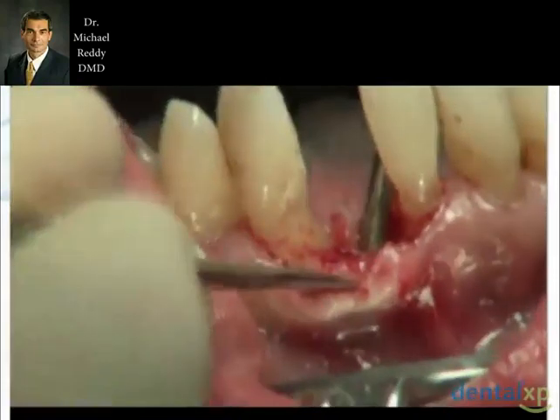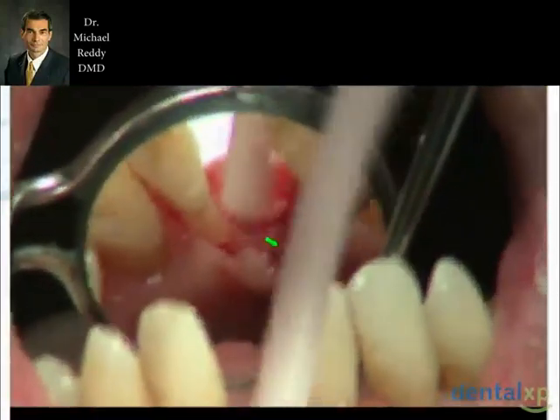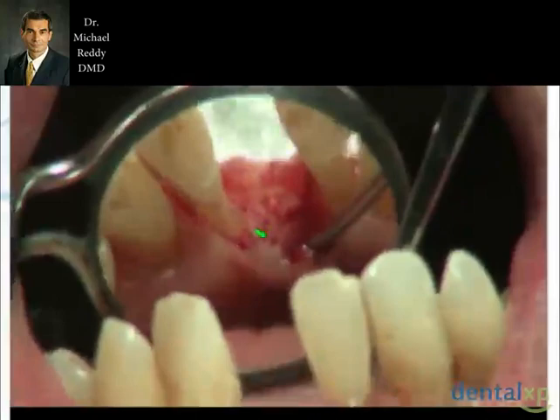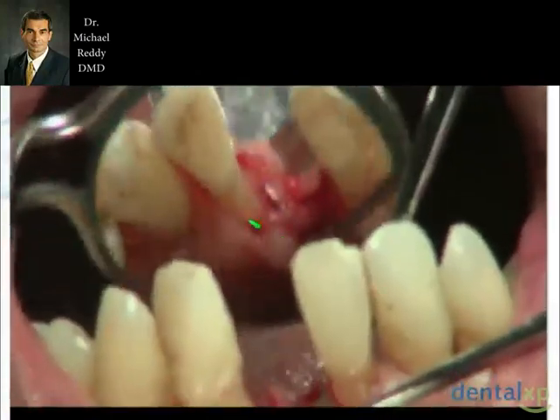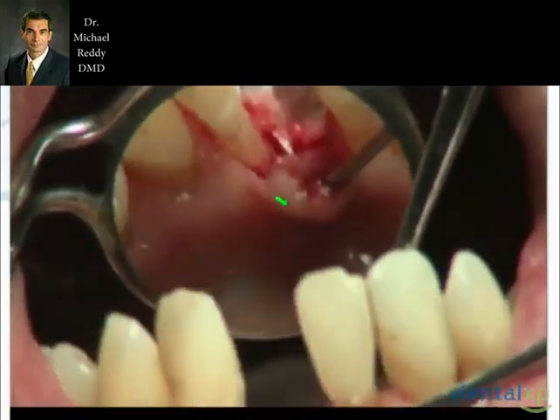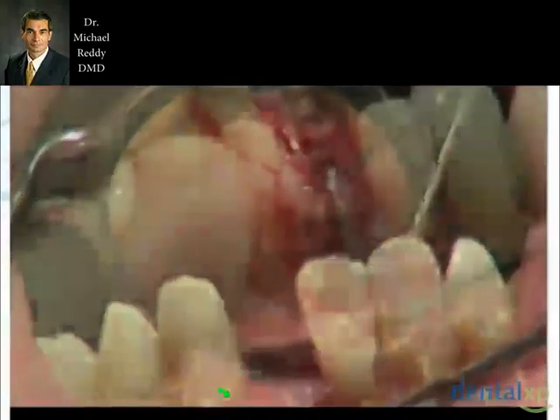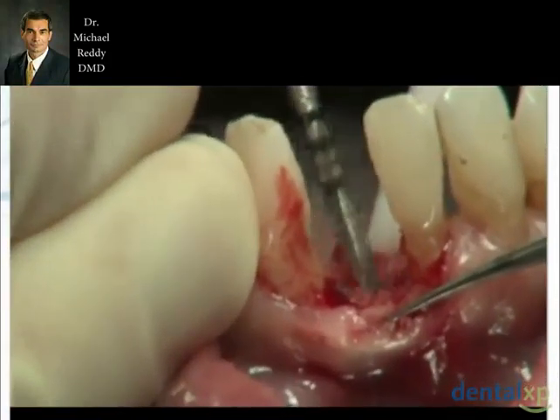And we can open this side up and look at the existing bone and the roots adjacent to it, and so we can see that we have a little over 4 millimeters, 4.5 maybe, of width, and probably almost 5 of space in between, maybe 4.5 in that direction, 4 in the other, to place it. So we're limited in the implants we have.